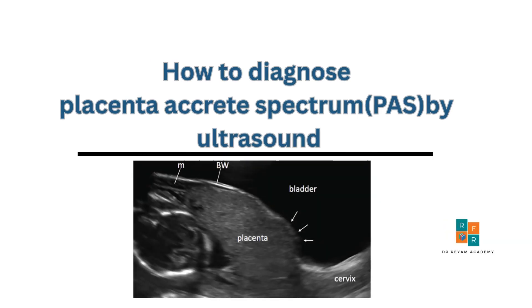Welcome to this video on ultrasound diagnosis of placenta accreta spectrum. Today we will explore the key sonographic features that help in diagnosing placenta accreta spectrum, from placenta lacunae to bladder wall signs and bridging vessels. We will walk through the most important markers to look for. Whether you are a student, resident, or practitioner, this guide will help you build confidence in recognizing the subtle and sometimes life-saving signs of placenta accreta.